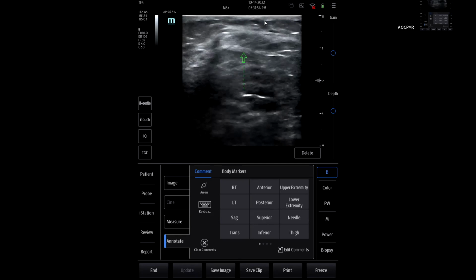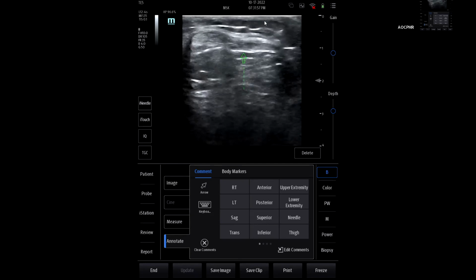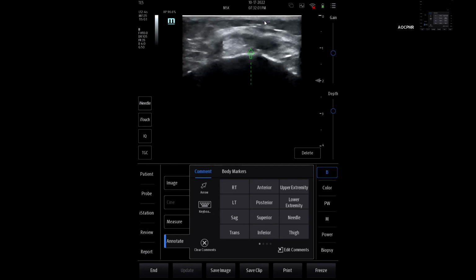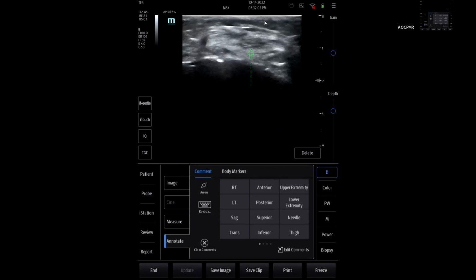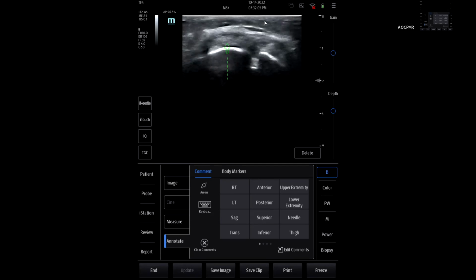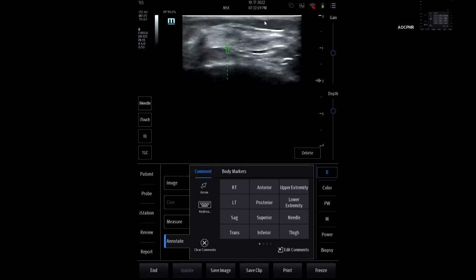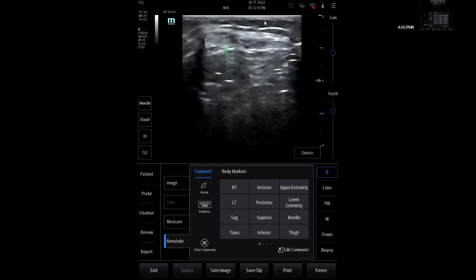And you're like, well, I don't think I could have told that. That's okay. When you've seen 100 patellas, then you'll have a better idea. When you've seen 1,000, that's even better. When you've seen 10,000, that's great. You see the divot where they harvested it. Yeah, you could feel it. I bet you can feel it.